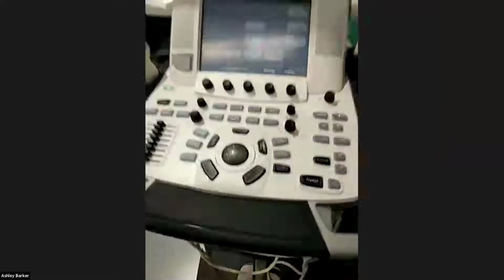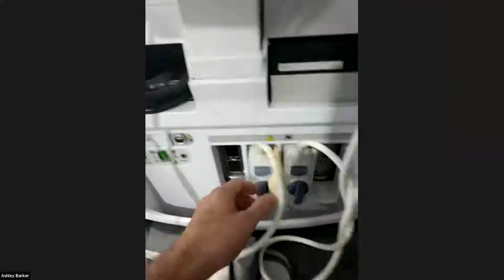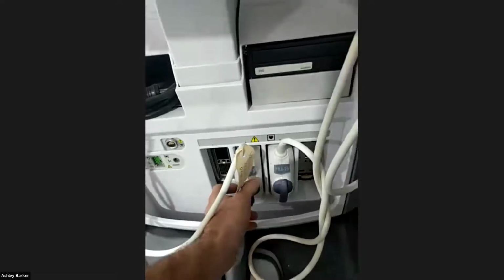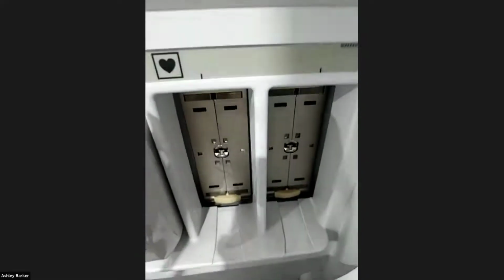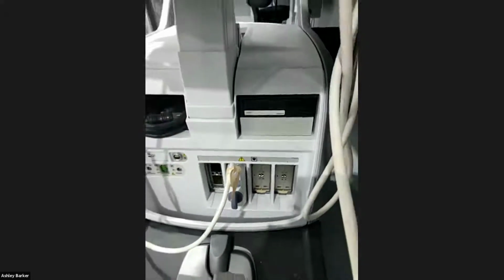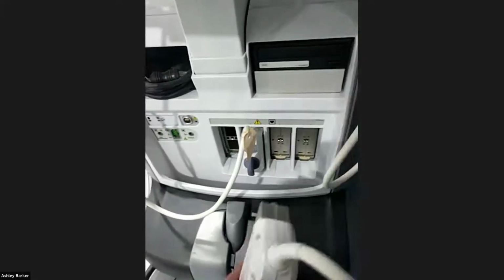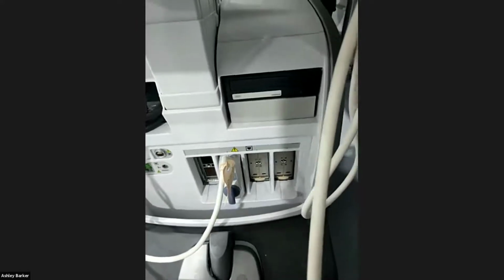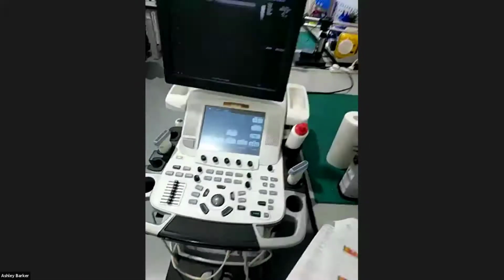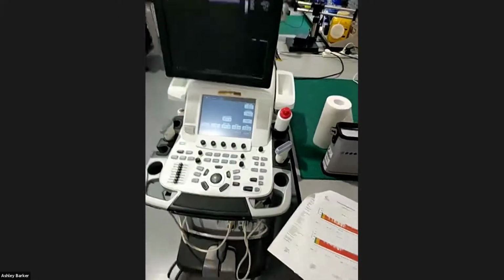Yeah, that is a huge thing. I got called out to a local clinic a little while ago. It was one of these GE pinless connectors where you can't actually see inside. They were saying that there was some dropout there and the probe wasn't behaving right. When I got down there, I was able to open this up and have a look inside, and there was a squashed cockroach. So it's quite amazing the things that work their way into connectors. But definitely getting any dust or any contamination in there at all is going to give you a bad day.